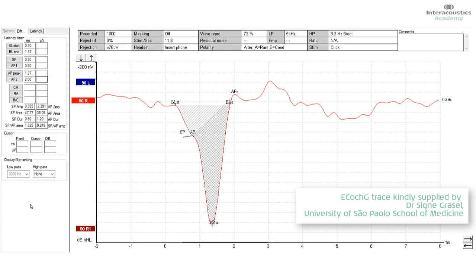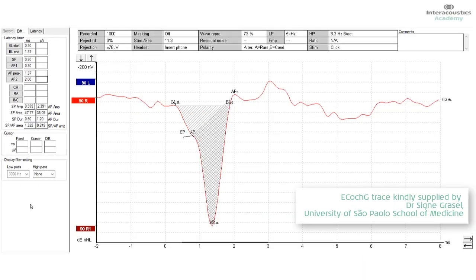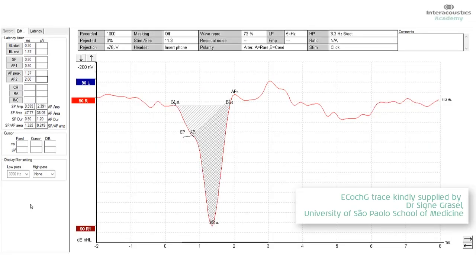So let me just go back and refresh us again what we did. BL start marks the beginning of the SP component. BL end marks the second place in the waveform, or the first place in the waveform after BL start, where the amplitude returns to the same amplitude as the start point.